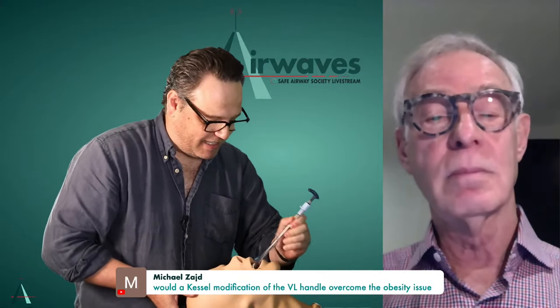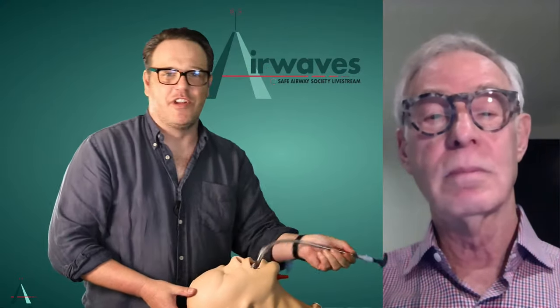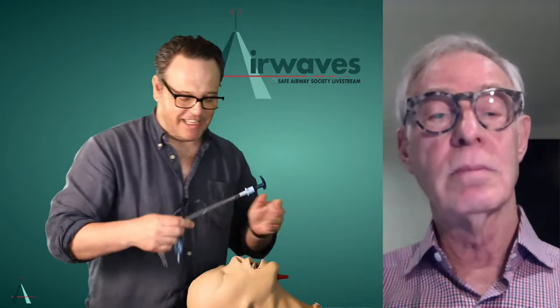Is that something you've tried, Richard? I have. I put my right hand under the patient's head and just lift. But I think that rotation of the endotracheal tube, the clockwise rotation, I describe as kind of like putting in an epidural where you get loss of resistance. As you rotate the tube, it disengages and you're not even pushing. You just feel it suddenly pop forward. It's funny you say that, because that was the exact analogy I used. It was like getting loss of resistance. You just felt it go. I was hung up like this and I couldn't do it, and then the trainee just dropped it in. It was very much like that.